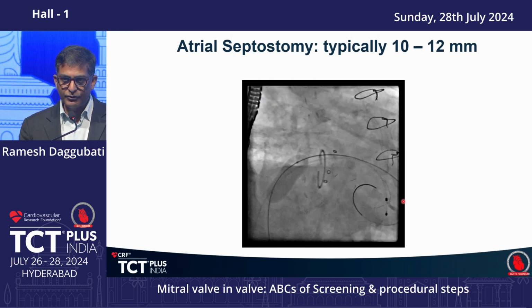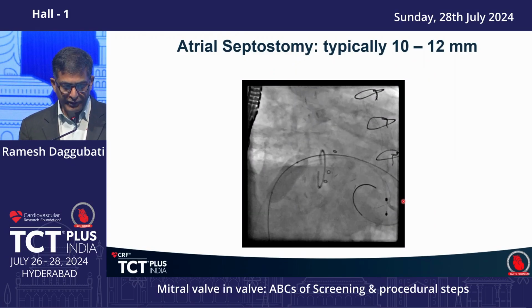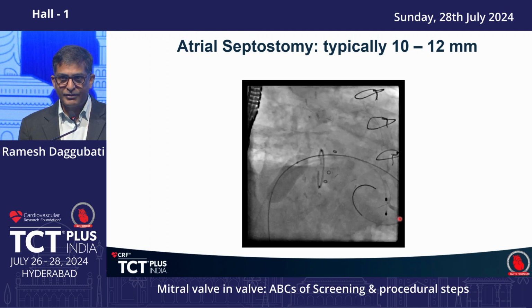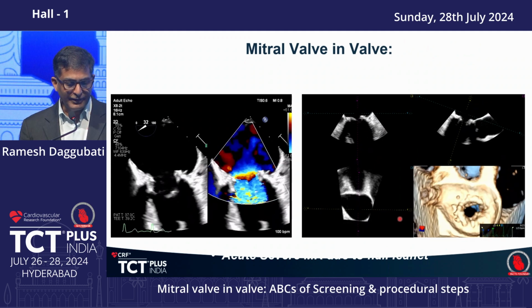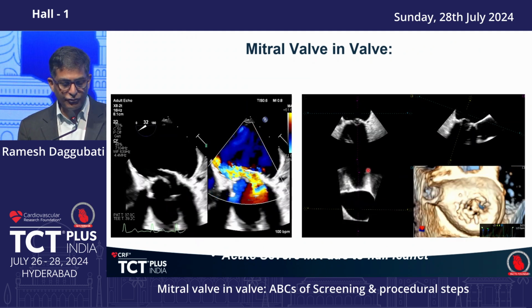If you can't get into it, it's difficult. Then anterior rotation of the catheter will help you get towards the mitral valve, and then you can use an Omni Flush catheter and slowly replace it. Sometimes you might have to put in a transapical puncture and snare that wire to create a rail. That's another important part that we might have to do on rare occasions.